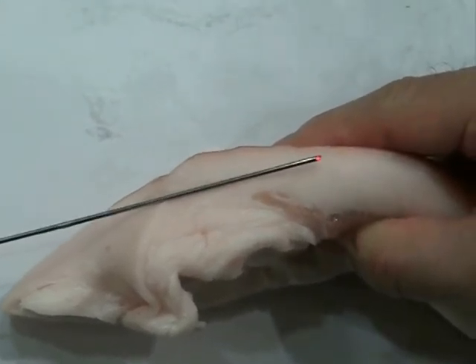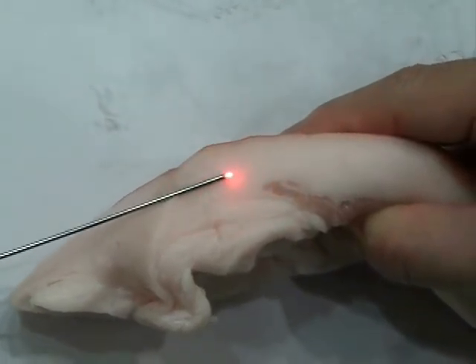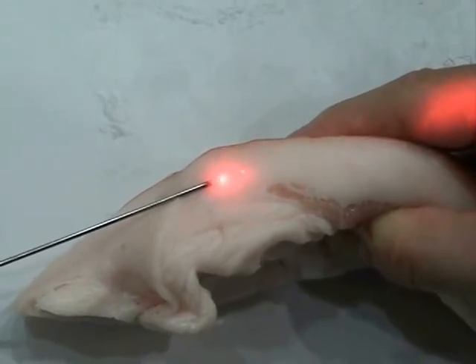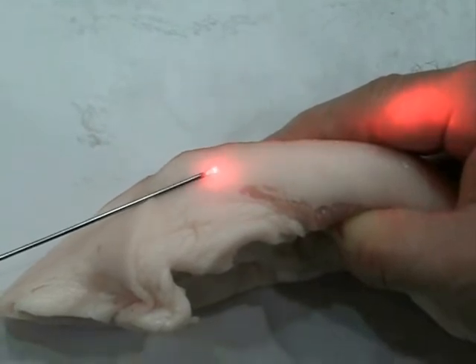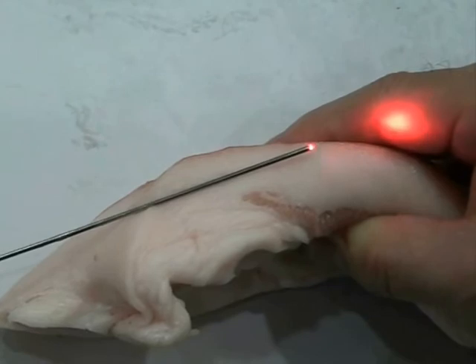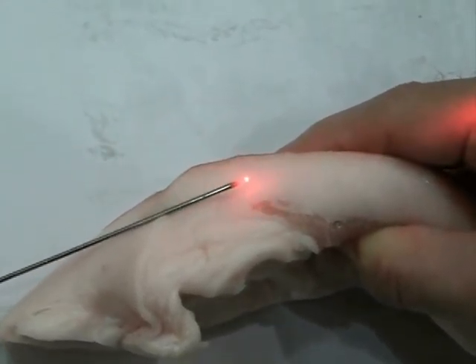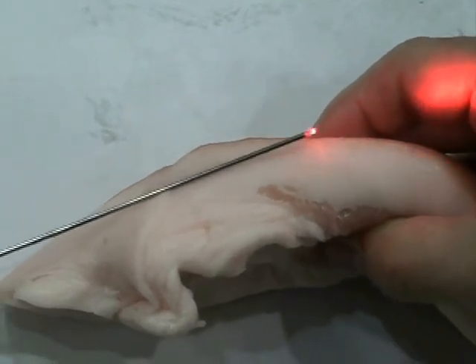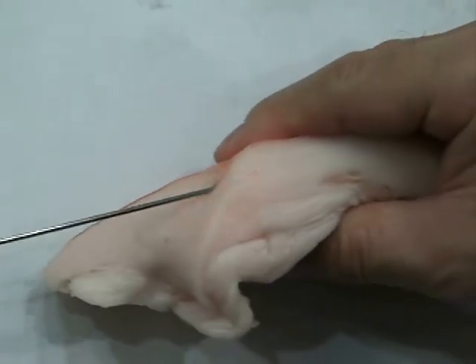Moving forward by pushing the head part of the handpiece forward, the fiber goes inside the cannula. The forward resistance to the cannula is low in a fat layer, but it should be stopped when it moves towards the dermis because of increased resistance. Then the operator exposes the fiber from the cannula and pulls back the cannula while emitting plasma light, so the operator can eliminate skin burn.